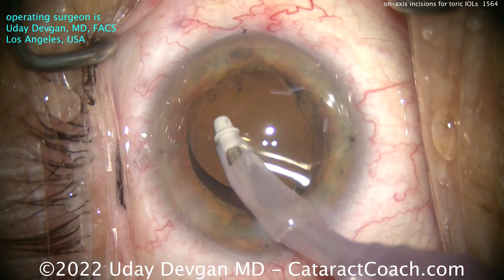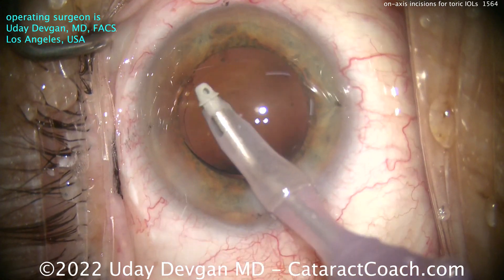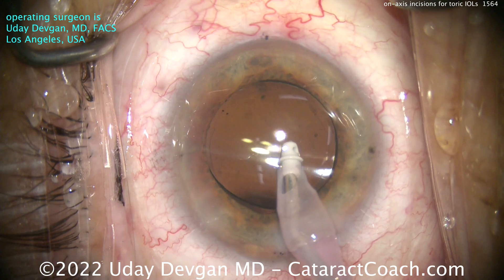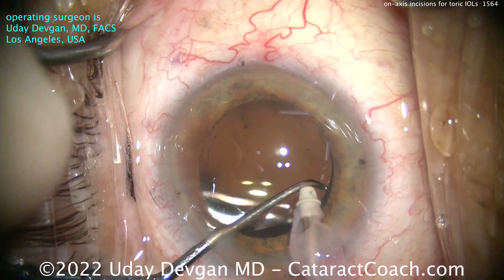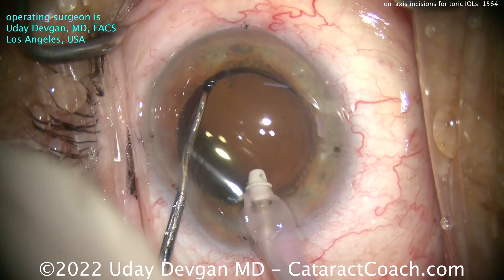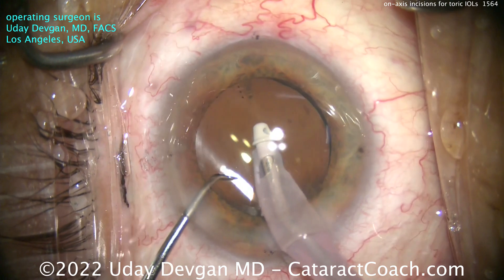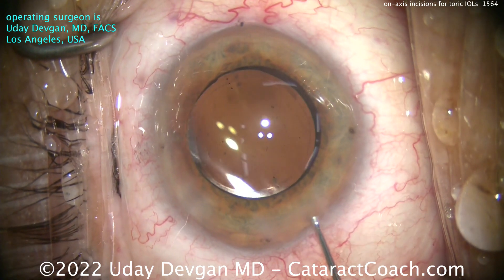So in a case like this, I want to take everything I can to get as accurate a result as possible. That means exacting pre-op measurements — looking at the topography, the tomography, the posterior cornea as well as the anterior cornea, and using multiple different machines to measure corneal astigmatism. When I plan this out, I try to get that phaco incision on the steep meridian. In this case, the toric lens was predicted to leave a little residual astigmatism since toric lenses only come in half-diopter steps at the corneal plane, so I made a slightly larger incision — about 2.7 millimeters wide — to help achieve that goal.